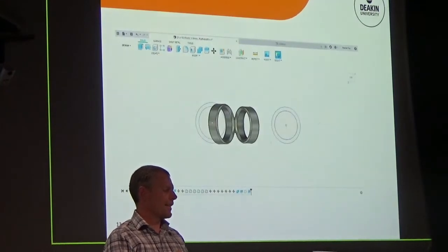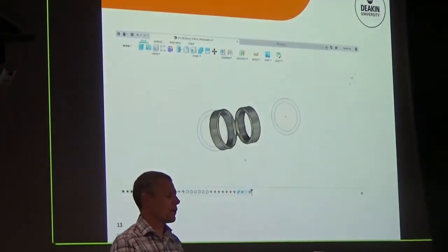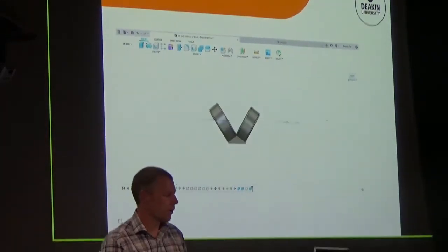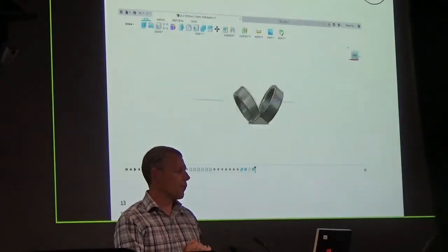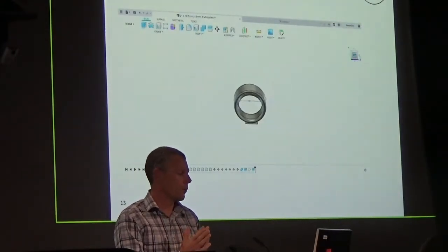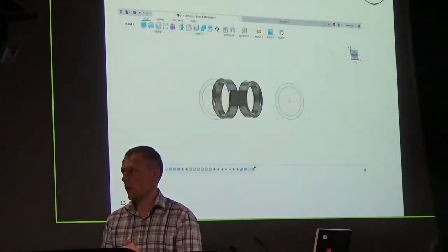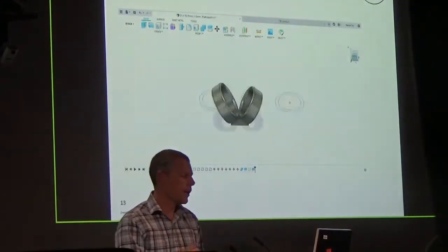With that, I've got exact measurements in terms of exactly knowing what the centre circle is to the outer circle, and I can modify them to whatever it might be. So then I end up with what looks to be some type of oval 8, figure of 8, whatever your wording is for it, through computer-aided design. So that bit of playing around took me a while to get my head around.